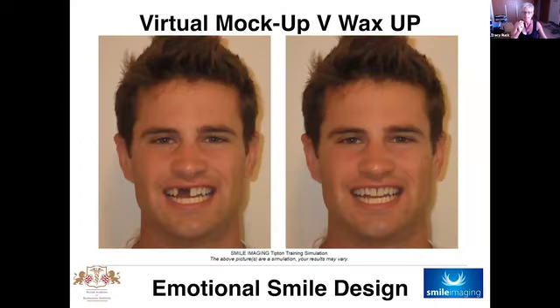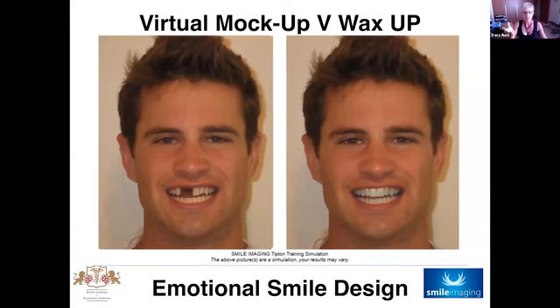And if that's the case, we can look at the 2 teeth, okay? And if he said, yes, I'd like to go with 4 veneers maybe and a whiter smile, then we can image that for him and show him that as well. So it creates the emotion, and allows them to try on the smile before they buy.